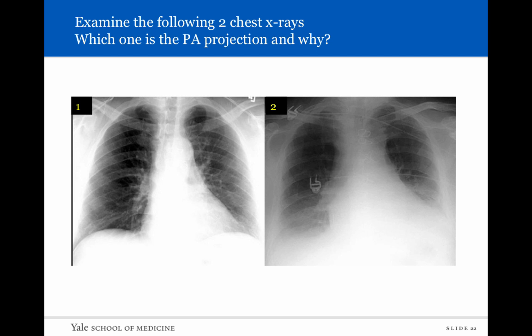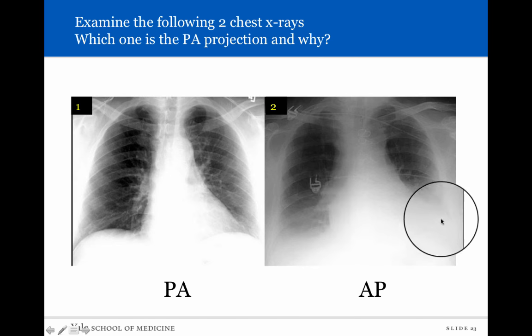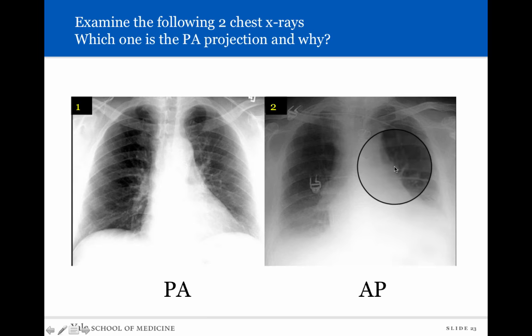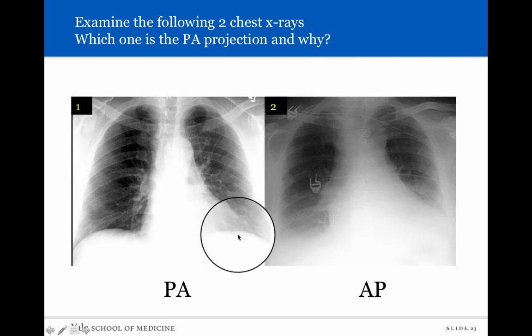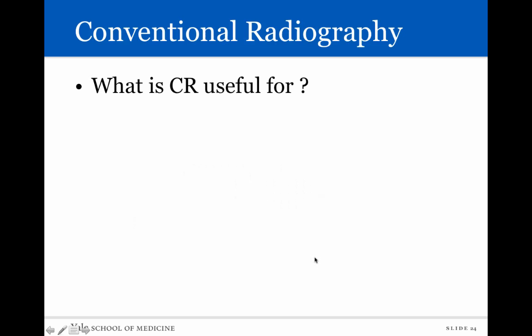Looking at two chest X-rays of the same patient taken a few minutes apart — one PA projection, the other AP — see if you can figure out which is which. The PA projection shows the heart with sharper, crisper edges. The AP projection shows the heart looking much larger, with very blurry edges, particularly on the lateral aspect. If you were to look at the AP image without context, this may seem like the patient has had too much fluid — maybe pulmonary edema — when in fact it's just a projection effect.